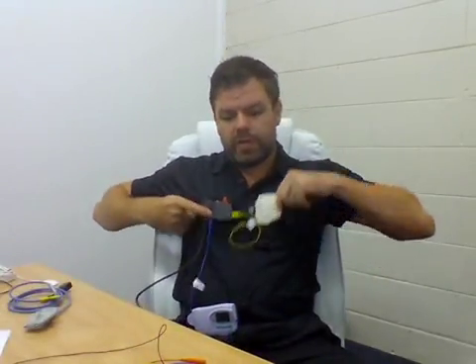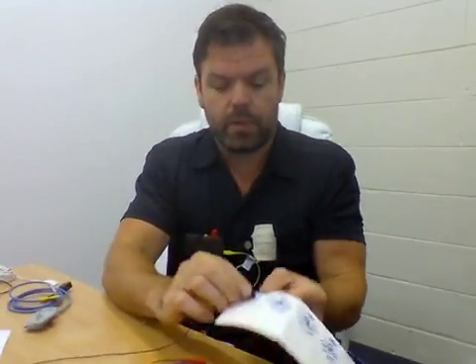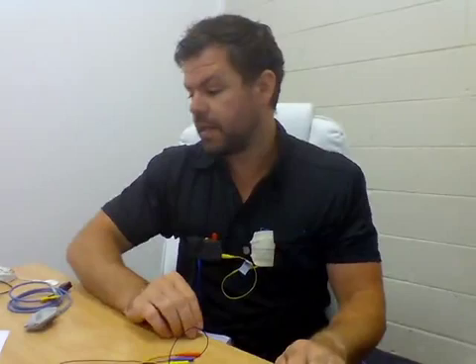So the first one we do is the black wire, and we do that, peel off a sticker, and that goes on your left clavicle, and your clavicle is your collarbone, so just on the collarbone here. The next cable is the yellow electrode. So we grab a yellow one, put it on a sticker, and that's going to go high up on the hairline on the left hand side. So if you're getting a bit of a receding hairline like myself, or if you're bald, just where your hairline normally would be, just up here somewhere. Okay. And that gives us our EEG, which allows us to see your sleep cycle, and also if you're having any interruptions in that sleep cycle.